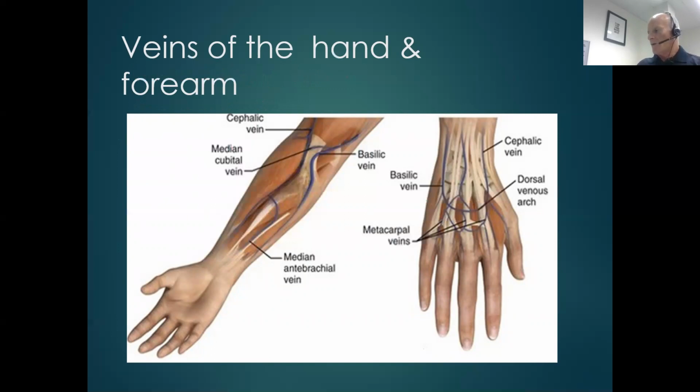Landmarks. Good people who have been doing this for quite a while have a very good understanding of the landmarks of that area. I've seen people cannulate patients where we can't see a vein at all, but because they know where the landmarks are, they're very efficient at being able to cannulate in the correct position.